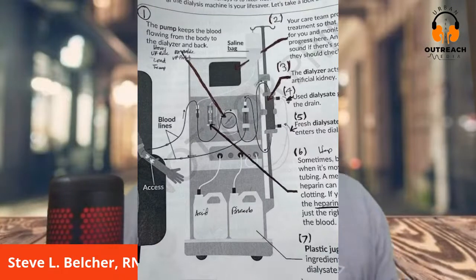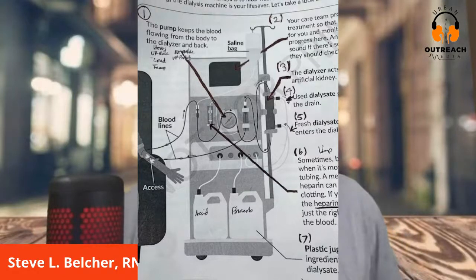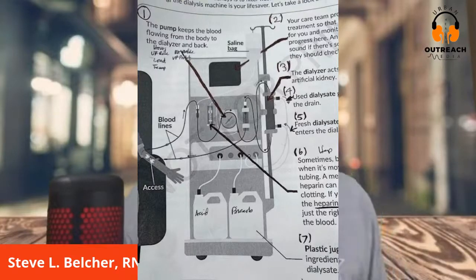Let me just tell you how important this machine is, okay? One of the jobs of your kidneys is to filter waste out of the blood. That's one of the jobs. The kidney has many jobs, but we're talking about filtering the waste out of your blood. When your kidneys stop working, the machine you're looking at on the screen is your lifesaver. That's the bottom line. If you're not doing PD and you're doing hemo, even with PD or home hemo, that's your lifesaver. So we're talking about in-center, this type of machine that can look like a Fresenius.